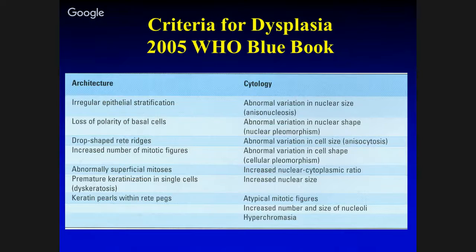So usually if there's true dysplasia, there's an increased NC ratio, there's an increase in chromatin, so it's hyperchromatic. If you look at the contour of the nucleus, it gets irregular, it's not smooth and round. And then there's a loss of polarity, there's loss of maturation, so that normal progression to the surface becomes lost, right? So just getting a little bit ahead of myself.